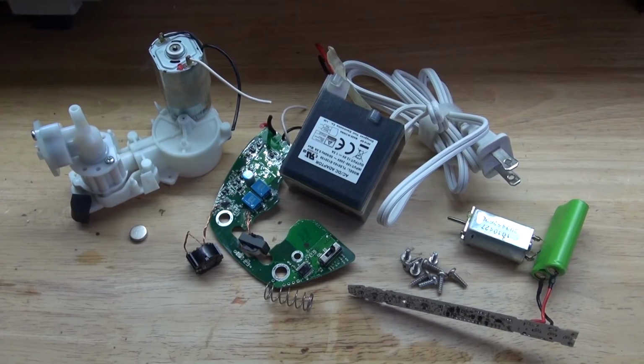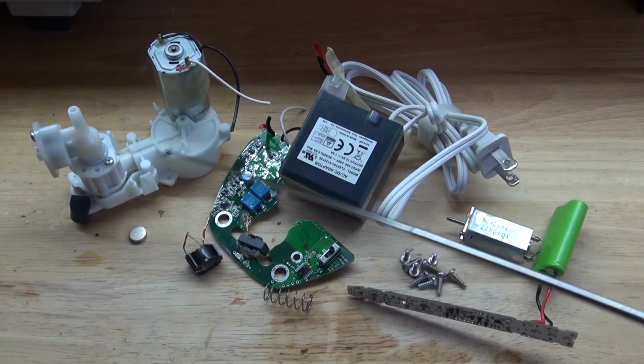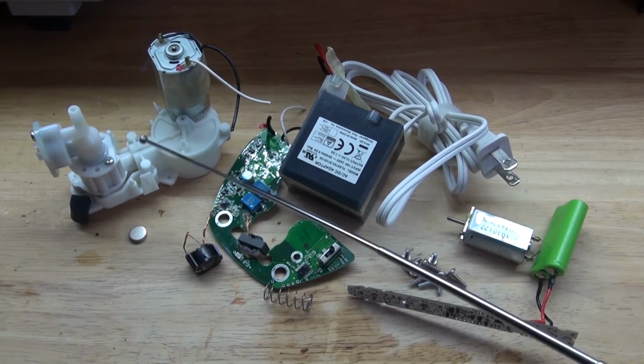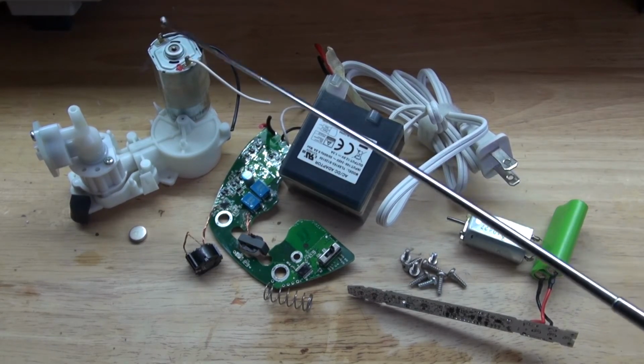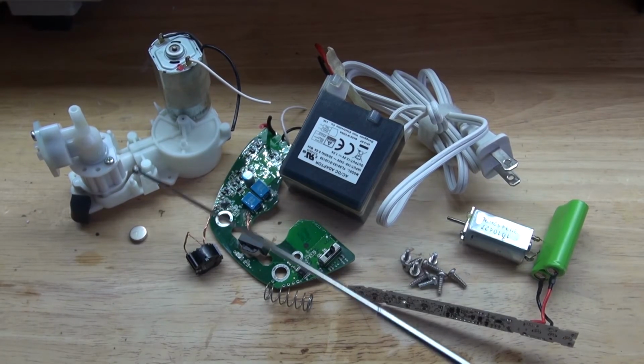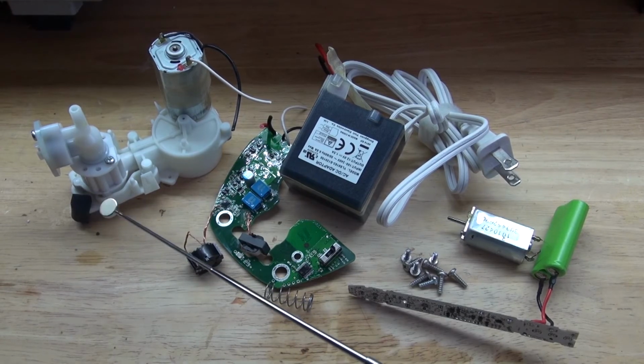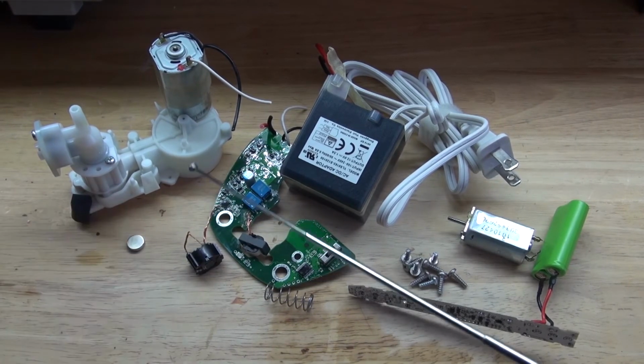And here are all of the items that I have salvaged. This right here is a water pump, and I can definitely use this for some kind of project. Maybe make a water fountain out of it. Not really sure, but I'll come up with something interesting with this. A neodymium magnet. These are always very useful for stuff. Definitely going to keep that for something.